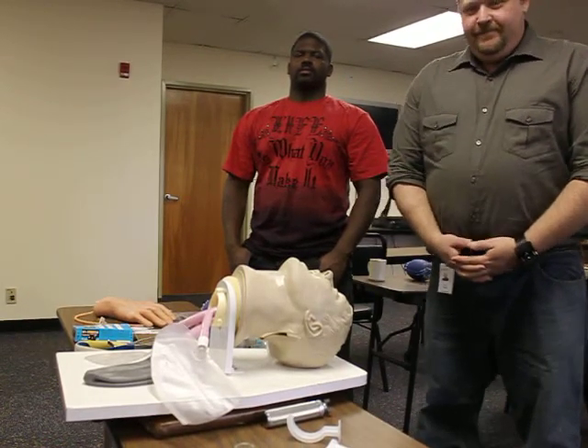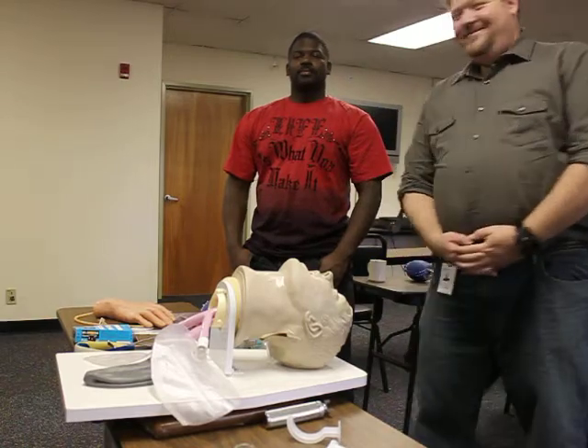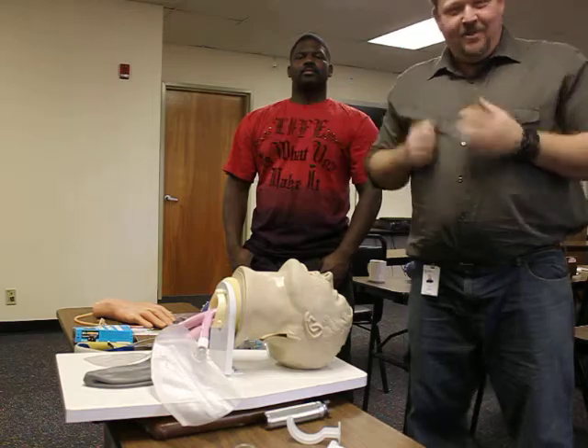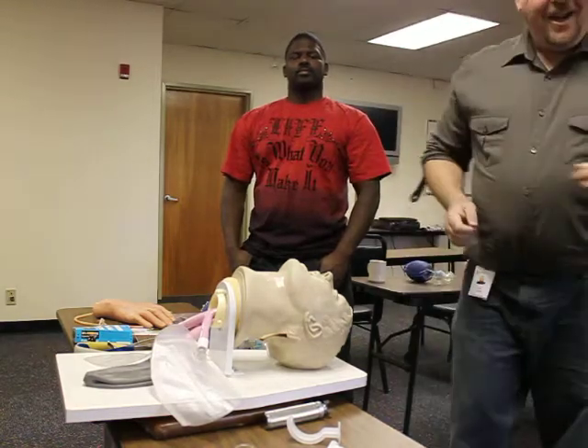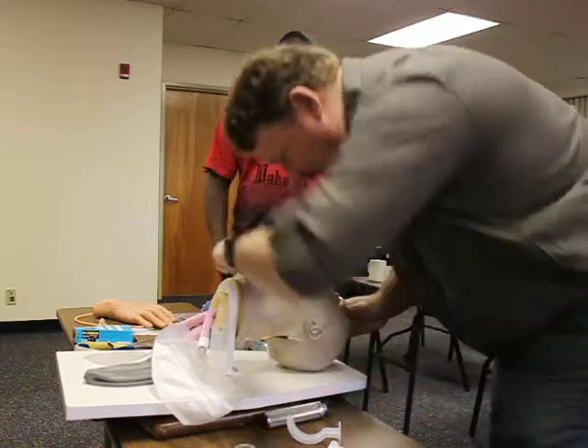This is your National Registry Alternative Airway Device and Superglottic Airway Station. I'd like to go ahead and select BSI at this time, make sure my scene is safe. I'm going to go ahead and approach my patient. Sir, sir, my name is Jim, paramedic — can you hear me? No response.